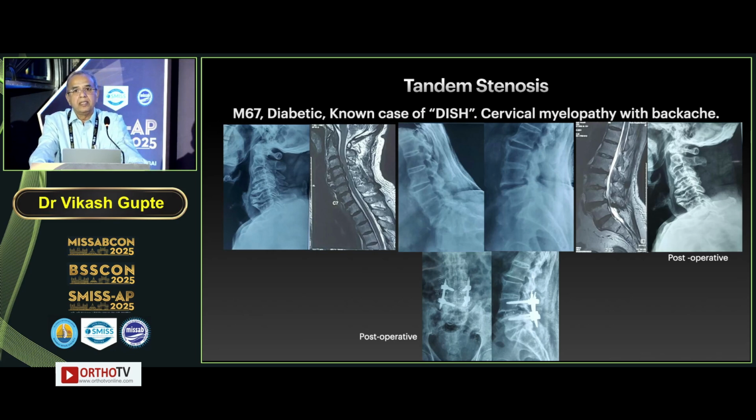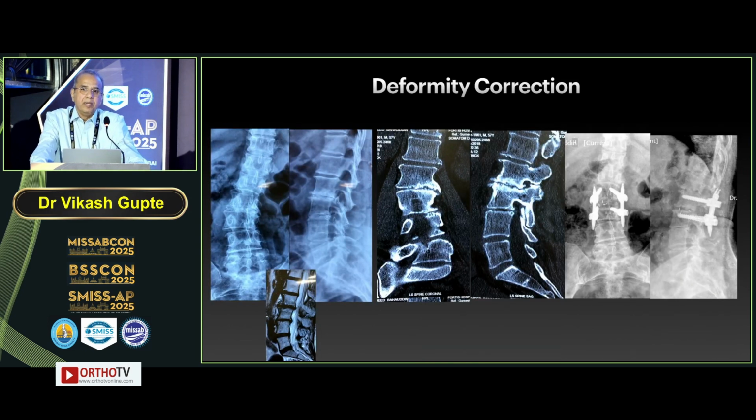Tandem stenosis: yes, in selected cases I do MIS-TLIF depending on the pathology, of course, and I do cervical and lumbar pathologies in one sitting. Deformity correction: now this is not a proper case to show, but this is very early. Nowadays, I may do OLIF for these cases, but initially we did selected-level MIS-TLIF.